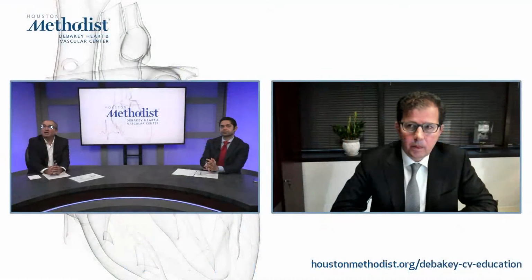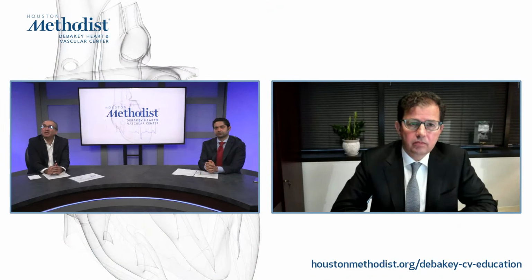Okay, great. There's one other question from the audience here. It says here, do you think every transplant patient should have a CMR at 6 months as routine follow-up? And maybe again, we'll pose this as, in your practice at Northwestern, is this incorporated into a strategy for all transplant patients where you're getting a CMR at some point, or is there a selected group, or how are the clinicians deciding, I guess?